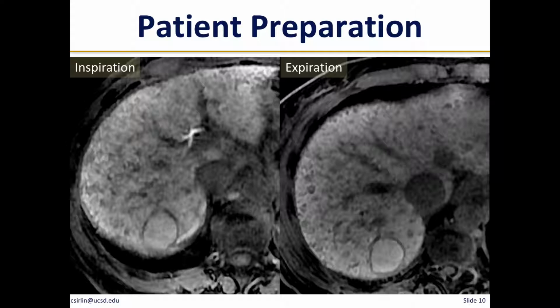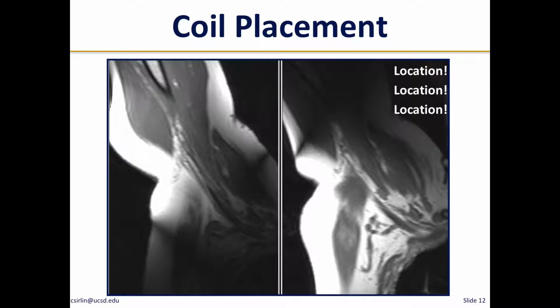But if they can hold it in expiration, do it in expiration. Location, location, location. It doesn't matter how smart you are with your MR physics. If you put the coils in the wrong place, you're not going to get good imaging.